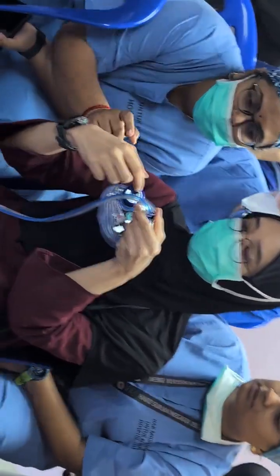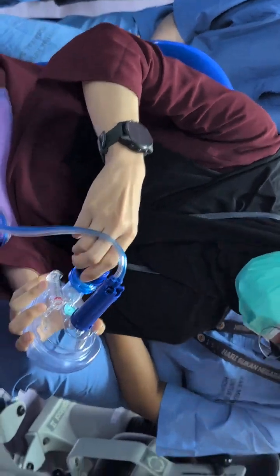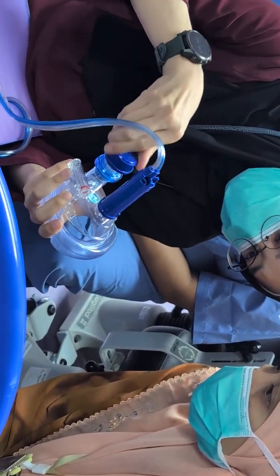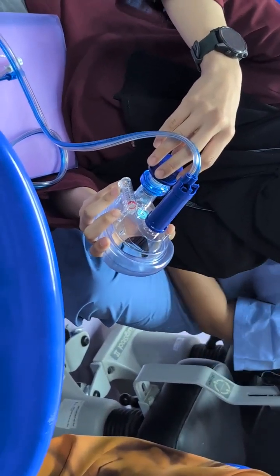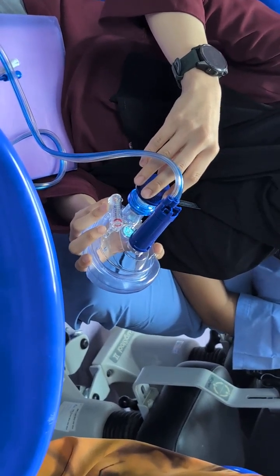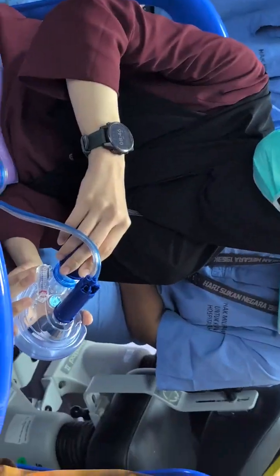Sorry? How do you adjust the mechanical PEEP? I tell you what, because yesterday when I was in KT, I was not allowed to use it on any Muslims because they are fasting, so I cannot really show you here. Actually oxygen is allowed. Are you sure? Very sure? It doesn't break the fast. Yesterday in KT they just refused me to do anything, so I did not do.